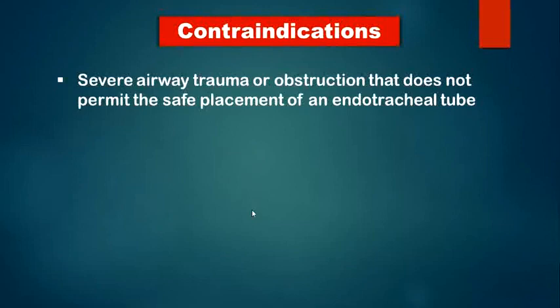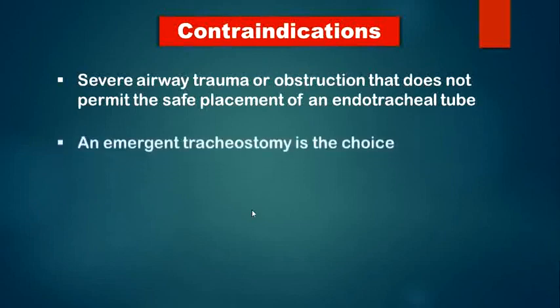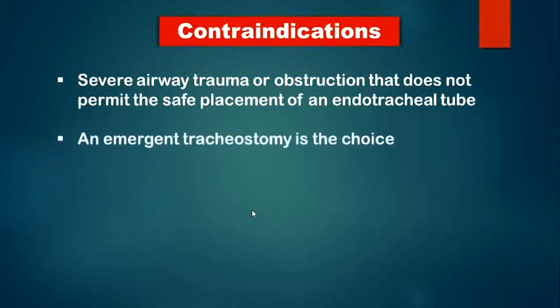Tracheostomy. Very good. If there is something that prevents the intubation or even the laryngoscope use, we should do tracheostomy to bypass this problem. Emergent tracheostomy is the choice.